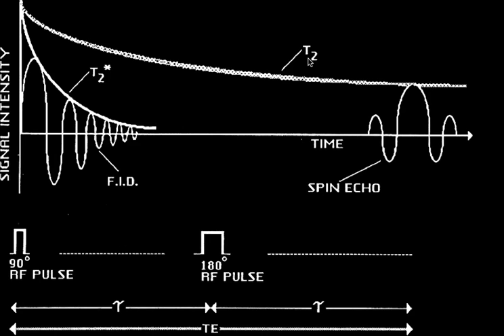We said, again, what's very important to us is that there is a difference between what happens to the protons that have to do with fixed magnetic field differences, which the echo completely corrects for, and the time-varying magnetic field differences that the echo cannot capture.